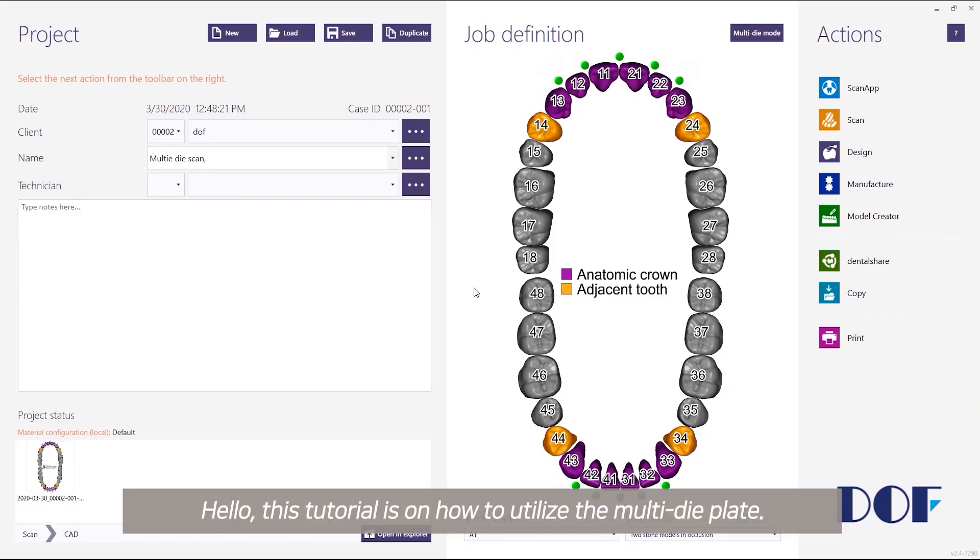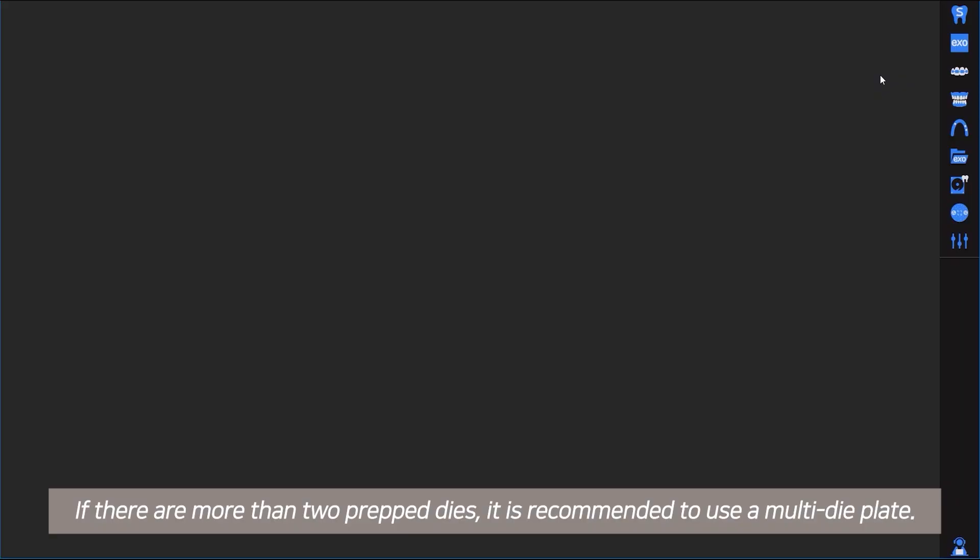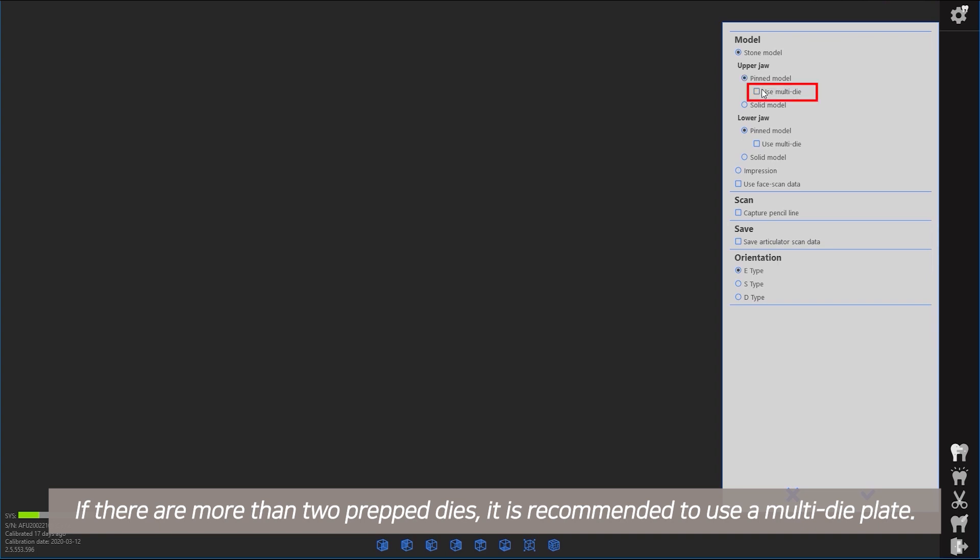Hello, this tutorial is on how to utilize the multi-die plate. If there are more than two prepped dies, it is recommended to use a multi-die plate.